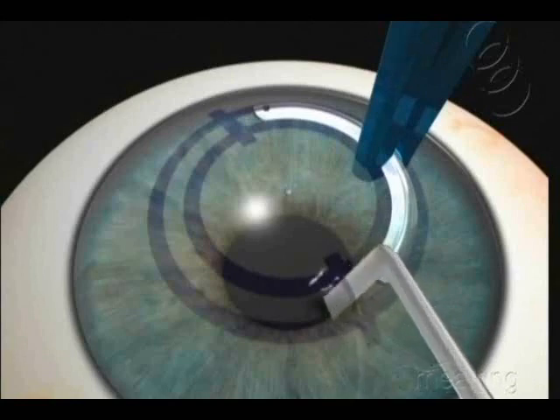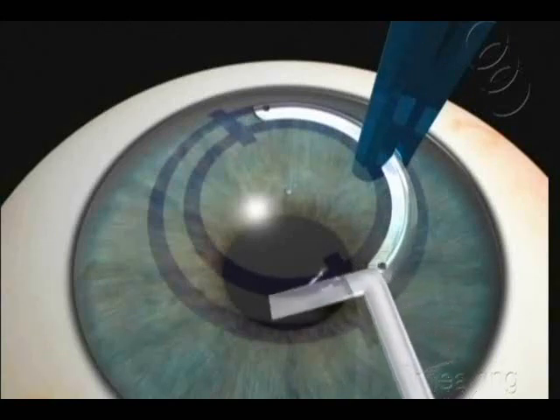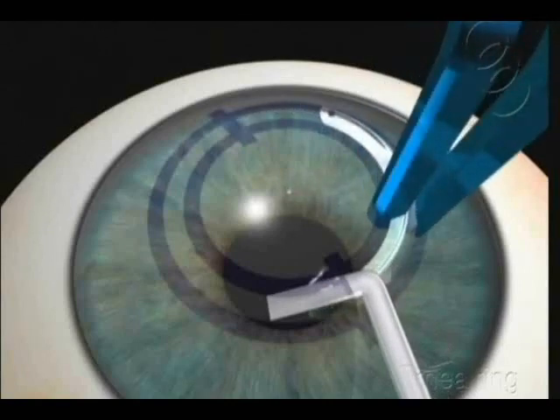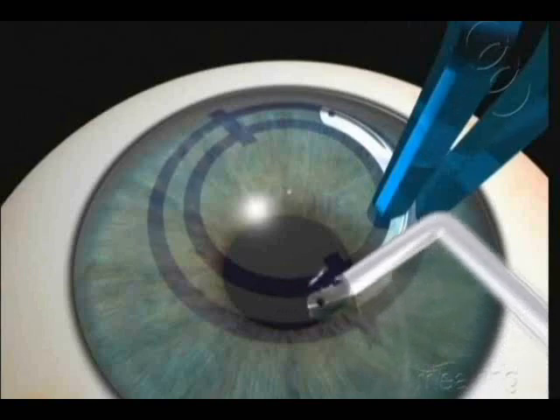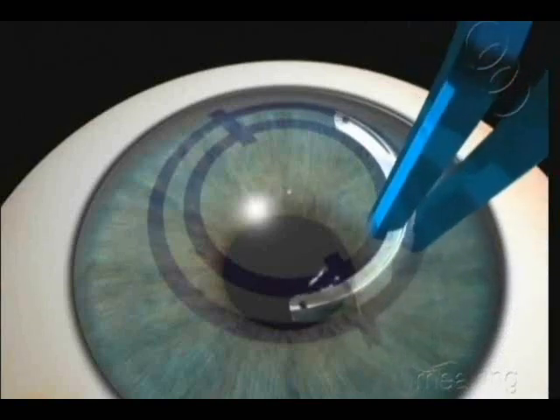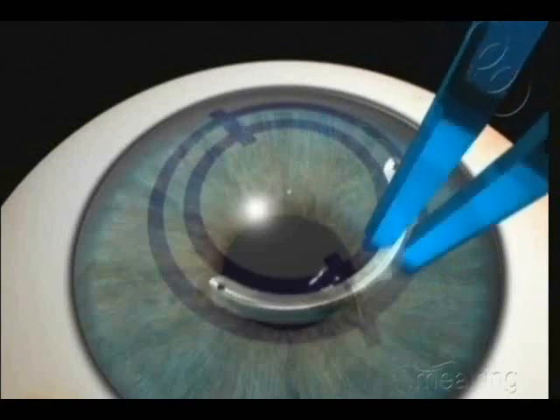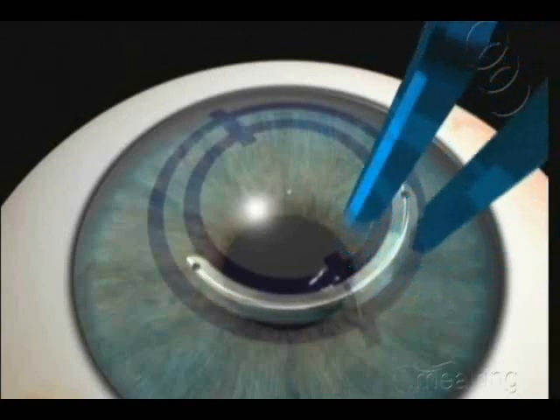Introduce the guide approximately 3mm inside the tunnel. Insert the ring into the tunnel under the guide. Remove the guide without releasing the segment. With short movements, insert the segment into the tunnel, leaving only its tip and hole still outside.